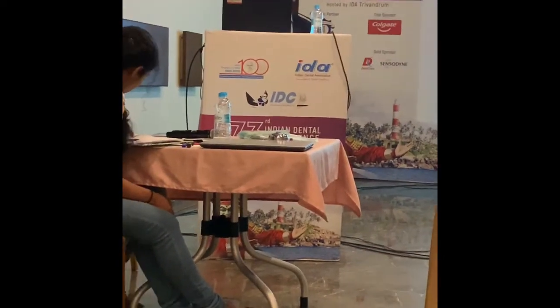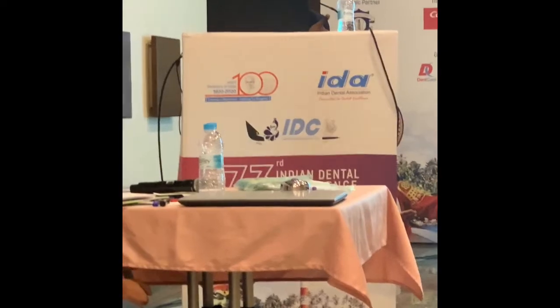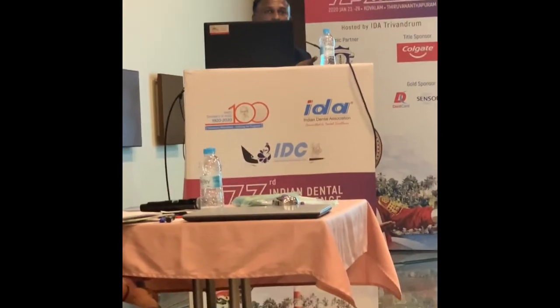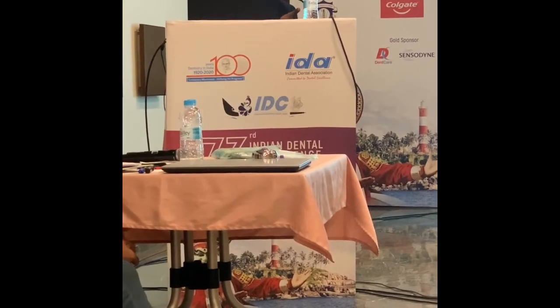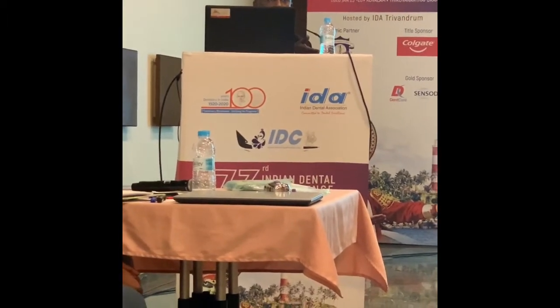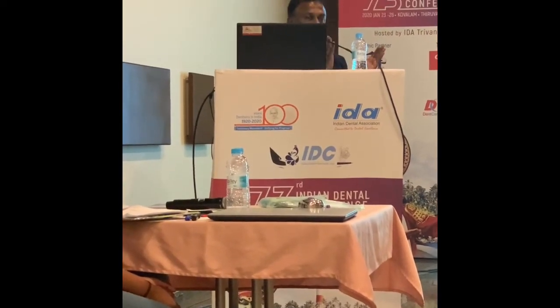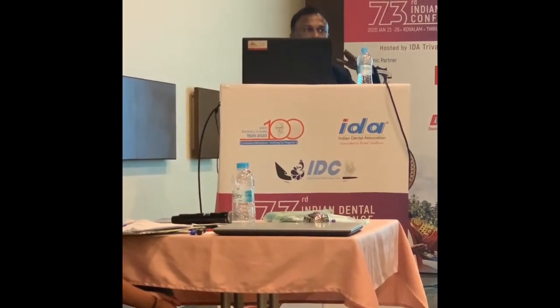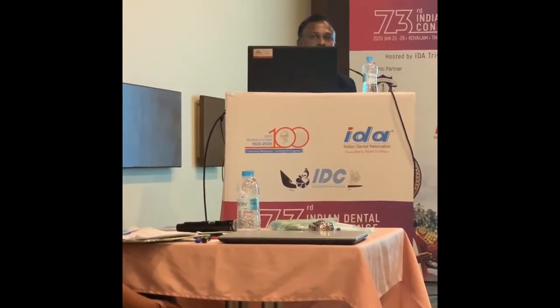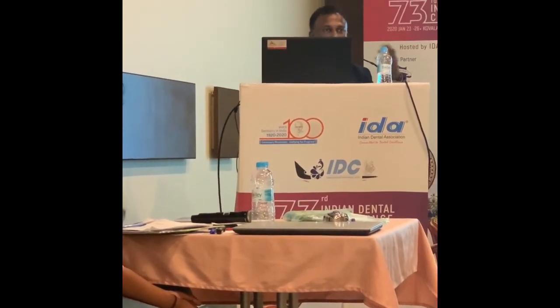So there are 2 concepts in this. Where the patient is completely edentulous and there is good quality of bone all around, you can put 6 implants. That is called the all-on-6, which has been patented by the Nobel company. Only they use that term, all-on-6. If on the posterior side the ridge height is very less and the sinus is so close, we will use 4 implants, and the 2 posterior ones you can angulate at 45 degrees so that you can increase the length of the implant you are placing. And then to make it emerge straight outside, you add something called a multi-unit abutment. You understand? So 2 implants will be tilted. That is the tilt concept, as they call it. In Nobel they call it all-on-4.